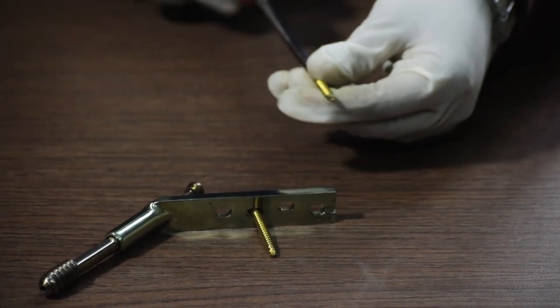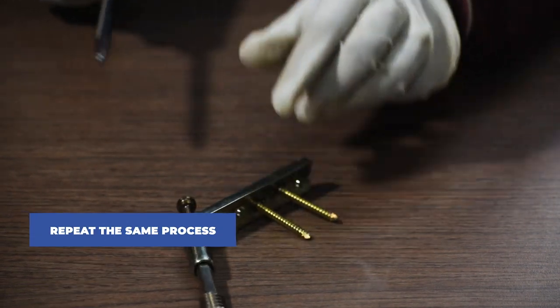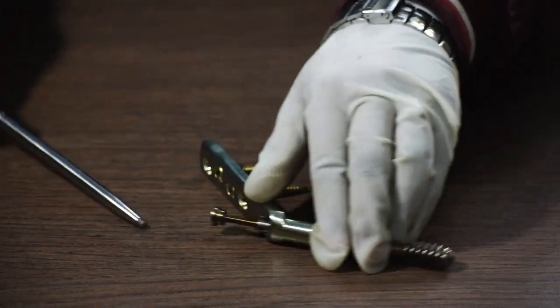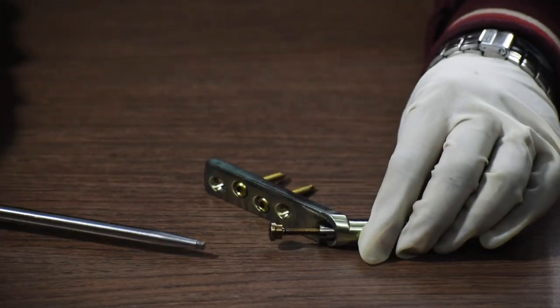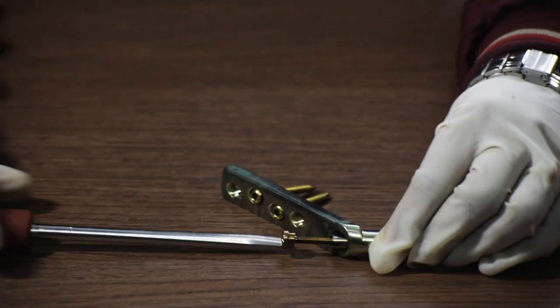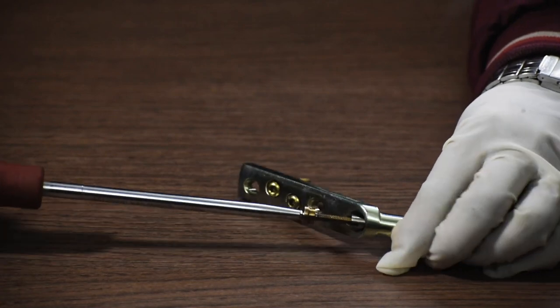We use the same process to fix any other screws in the shaft region of the plate. Thereafter we will tighten the compression screw which was previously placed in the top of the lag screw. This will help in the compression of the fracture.